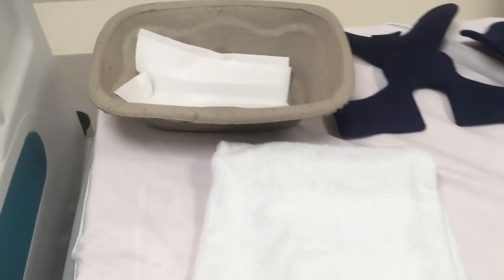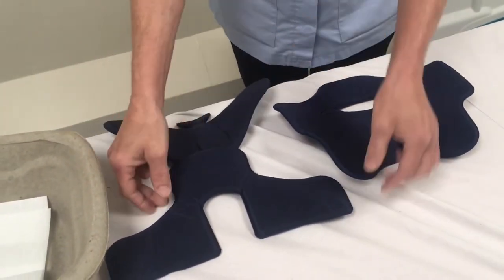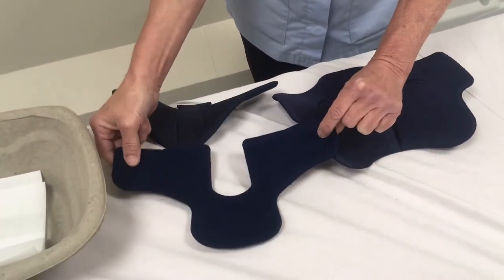For collar care you're going to need a bowl of warm water, your dry and clean liners which you've prepared earlier laid out separately, and you're also going to need a dry towel to clean the patient's neck.